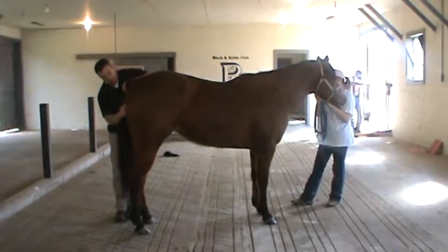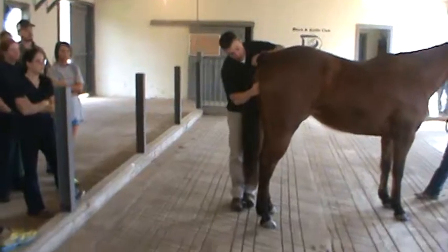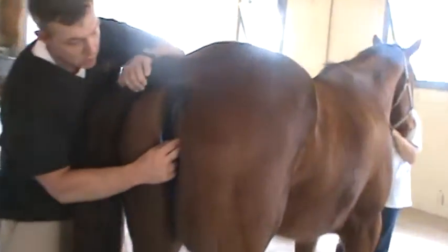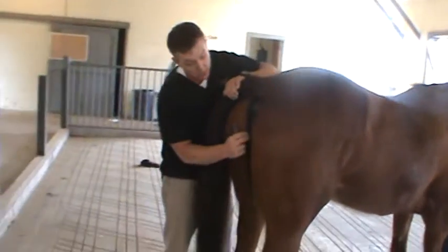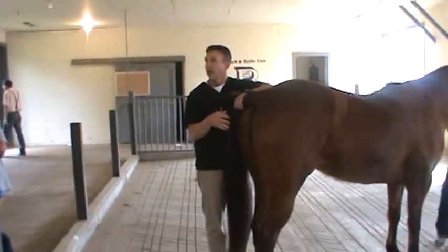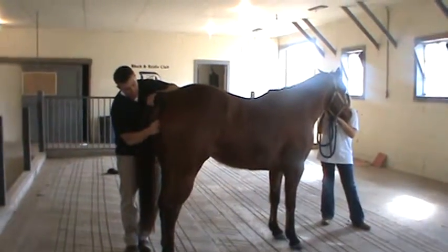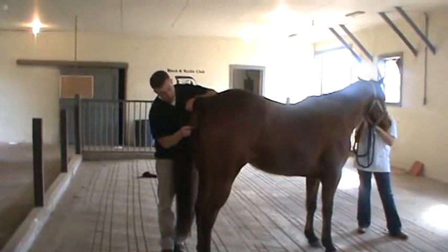Also, if we open that up and look and make sure that there's no redness, no irritation, that also tends to tell us that this mare doesn't have a problem keeping the lips of her vulva closed, because if she were red and irritated there, that might indicate that chronic inflammation and infection has been going on there. So it's a good pink, it's normal, it tells me everything's very good. Another thing that we can do is just look at the apposition.